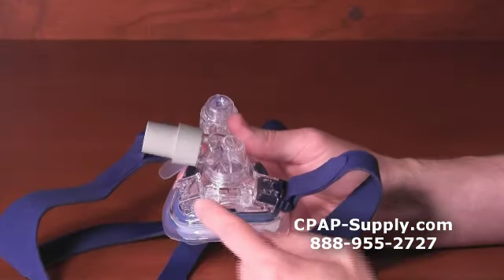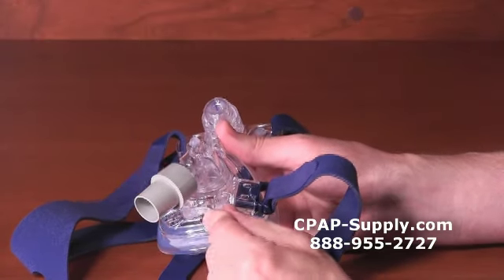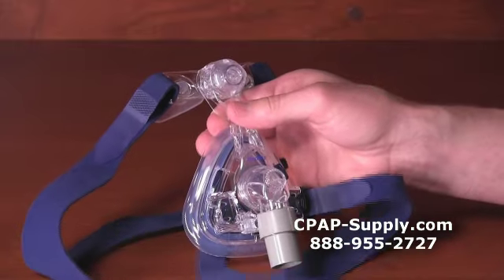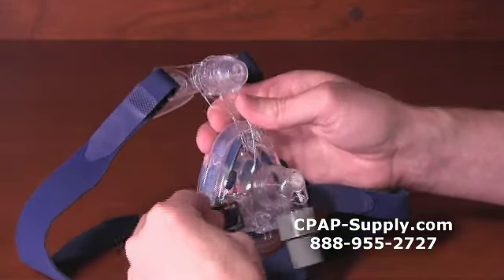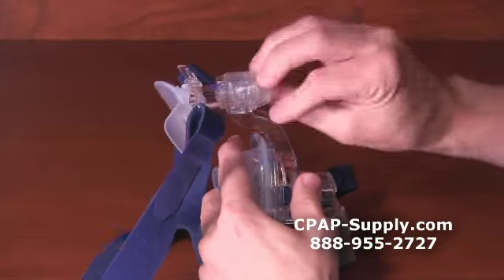Two oxygen ports are located at the bottom of the mask frame. These can be used for supplemental oxygen and are compatible with standard oxygen tubing. The Activa LT also features two quick-release headgear clips and a forehead support that can be dialed to 24 different positions.